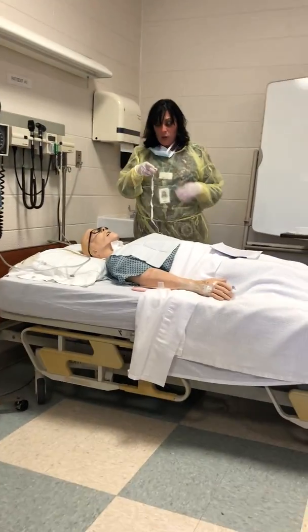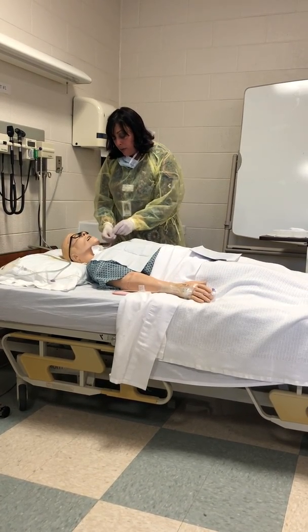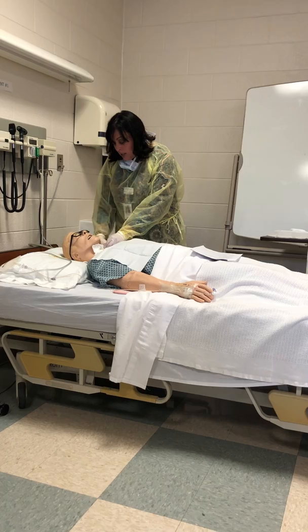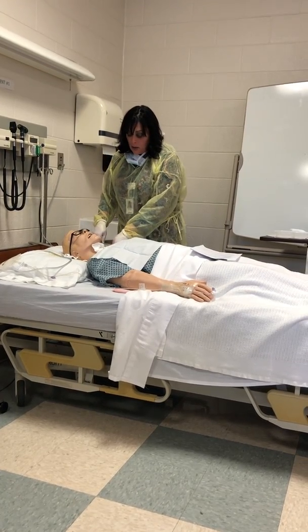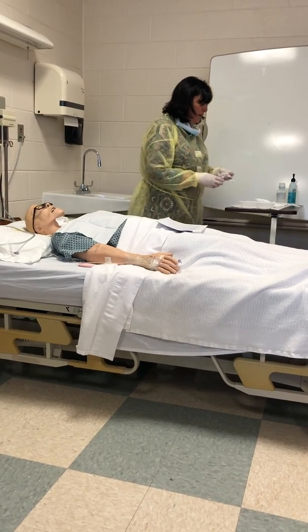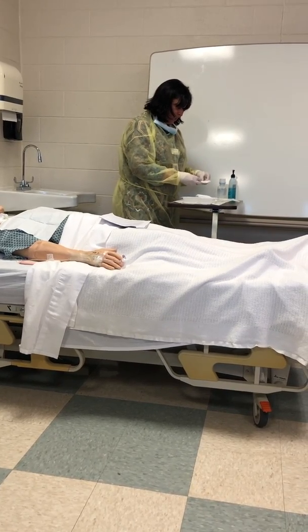Usually they have the foam ones that are Velcro. But when you attach a new trach tie, whether it's these or the foam ones, tie that in, wrap it around, tie the other side in, and then undo your old one and remove the old one. And then document, and again, make sure that you have an extra trach and hemostats at the bedside. Any questions? Did I do it right?